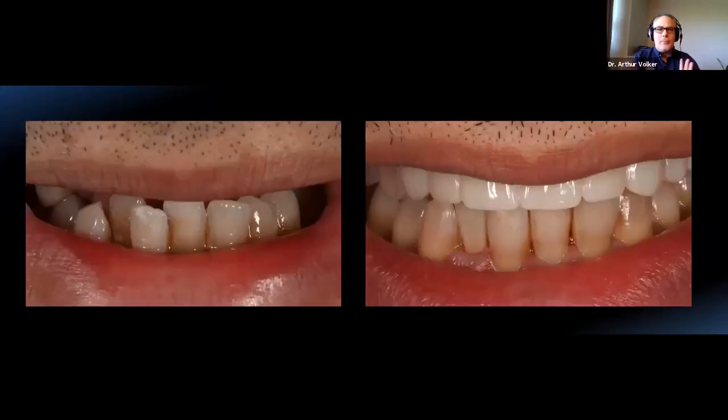And this is the before and after case. Like I said, the only reason I'm showing you this is because using a good lab, using good digital technology, using appropriate techniques, the most labor intense part of this whole case was just doing that direct composite on tooth number 26. It can be that easy. So again, I just put this out here to consider some options for those of you who are doing a lot of zirconia or larger cases.